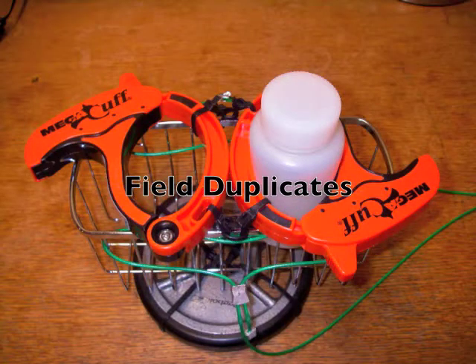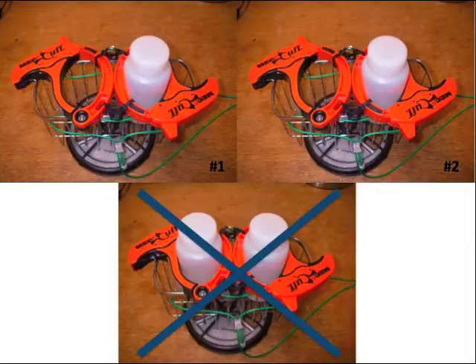This section will review important sampling order information for when you need to take field duplicates. When you are asked to take a field duplicate for your bacteria sample, you will have to lower your basket twice, the first time for your regular sample and the second time for your field duplicate bottle. A regular sample and its field duplicate should never be taken together.